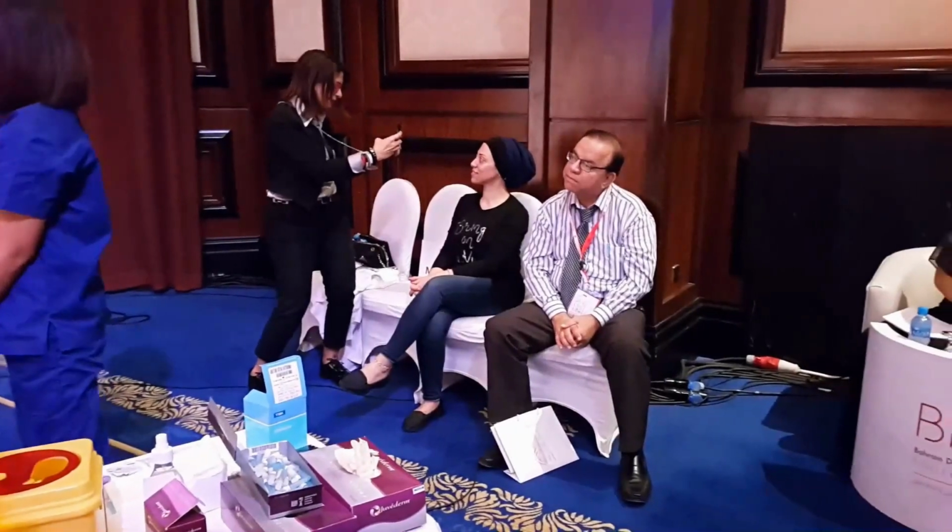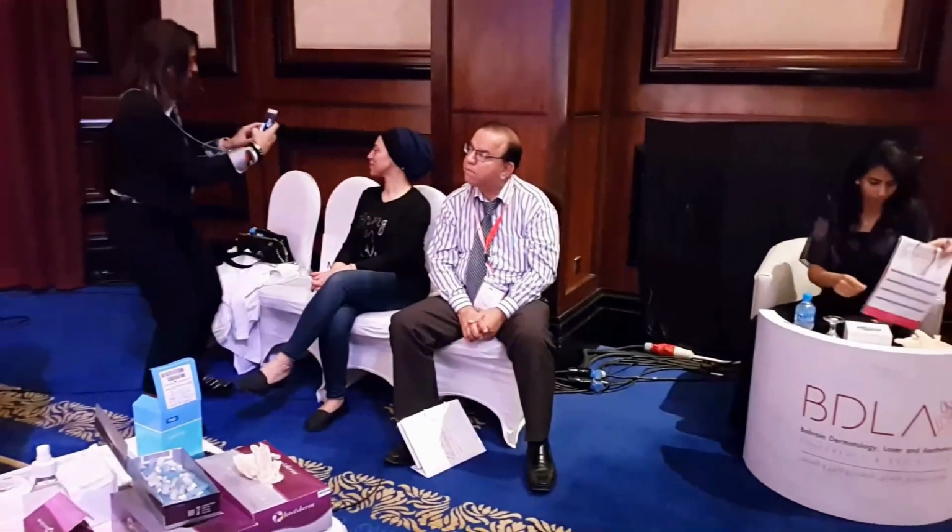Yes. But actually, in my opinion, we have to suggest to ask the patient first, the comparison, her acceptance of the job. Second, the suggestion is that because I noticed being very careful not to puncture more, the length of the needle will be localizing the filler to a certain area, which actually augments the zygomatic body only. But if we want it more natural, we go to the arch. Part of the arch. Yes. The posterior zygomatic arch.